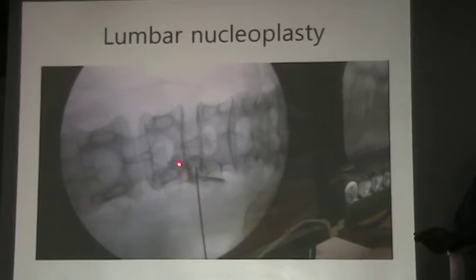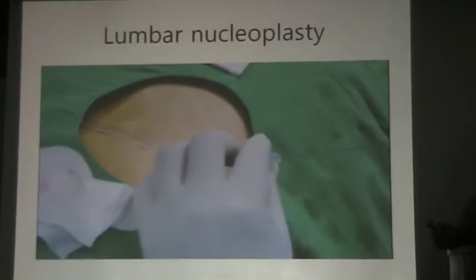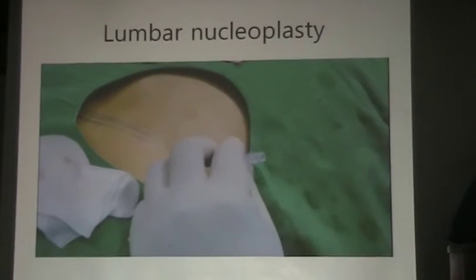You can see the safe triangle, and insert the needle into the disc space.